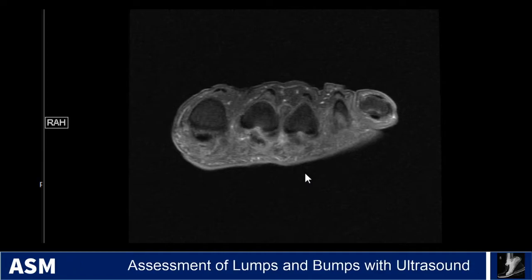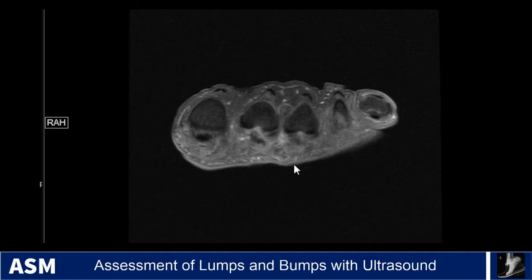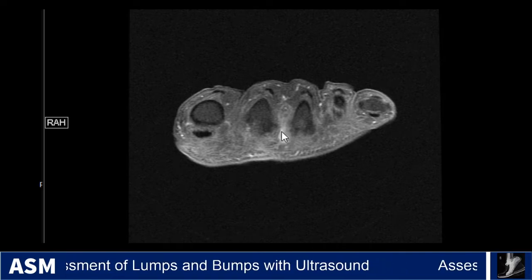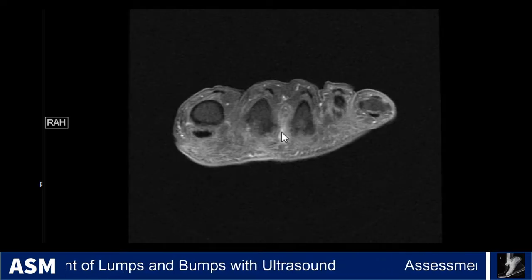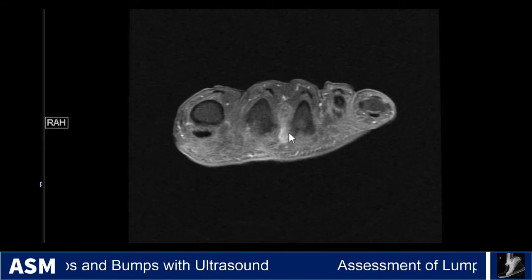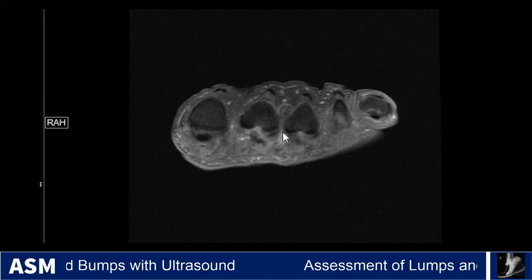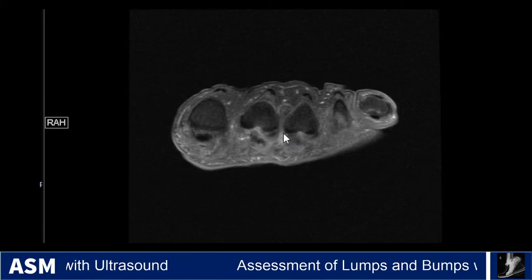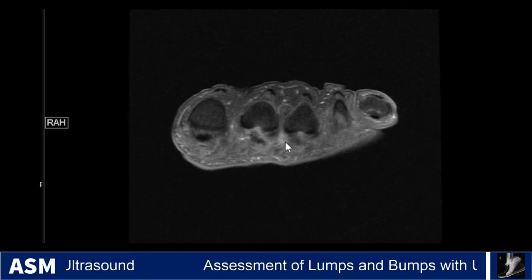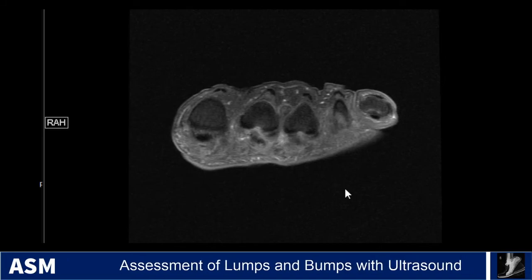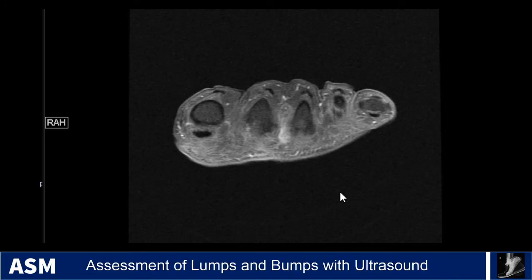On this coronal T1 fat sat post-contrast image, we see that there is an enhancing nodule along the plantar aspect of the second web space below the intermetatarsal ligament. Contrast is not always necessary but sometimes helpful. The T1 and PD or T2 are probably sufficient to make the diagnosis in most cases. On ultrasound, when it's large enough, you can see it as well. This was removed and pathologically confirmed as a Morton's neuroma.